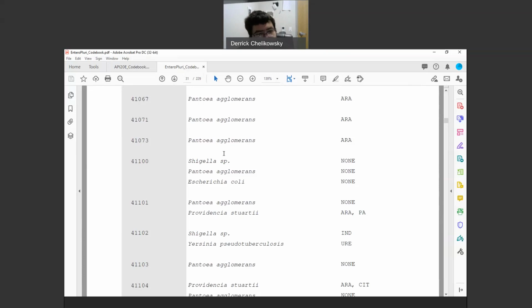So now that we have this, if let's say your unknown came up with this code, how would you choose it to be? How would you know not to use Pantoea? We know it's not Shigella because I just told you that we don't have Shigella as our unknown. It's also a human pathogen. So how do we go about teasing this out?